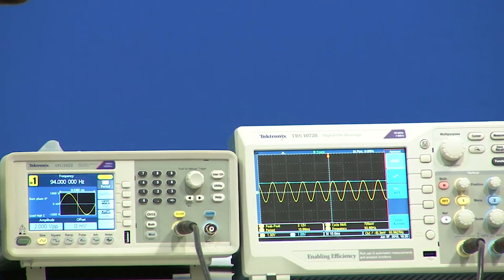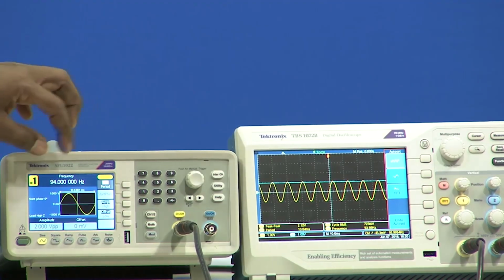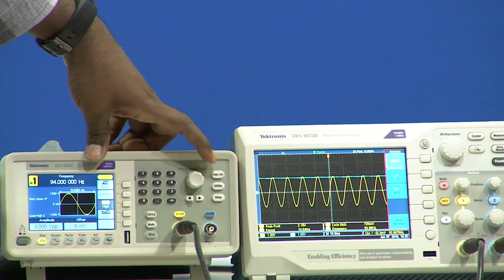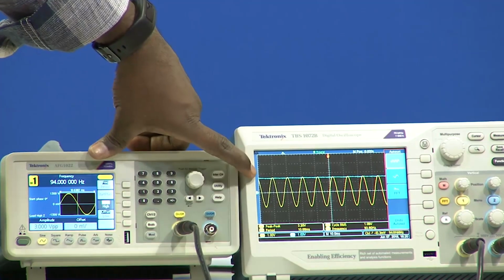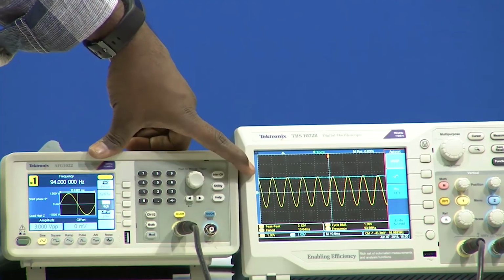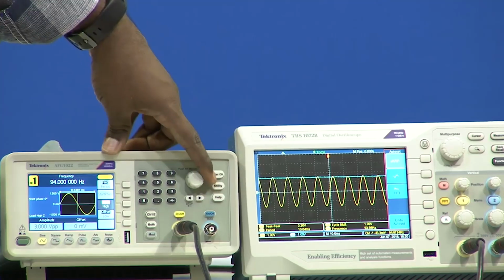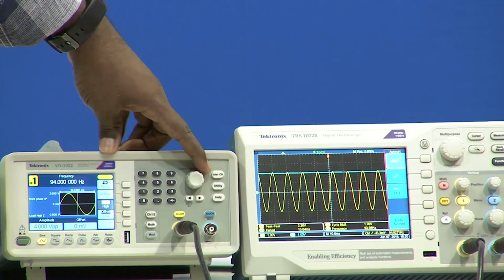So, the 2 volts peak to peak value. I am increasing the voltage, so I will go to the amplitude, I will change it to 3 volts, that means 1.5. Now see the capacitor, because of the 1 microfarad capacitor, it is quickly charged and it has gone to that particular peak value. Now if I slowly increase, even then we can see.